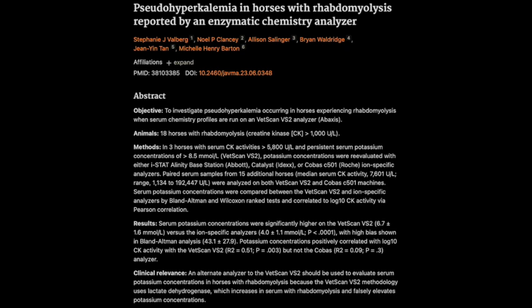So maybe it's not that vets don't know about it. Maybe it just gets lost in the shuffle. Yeah, it's easy to get overwhelmed with information sometimes. But either way, this situation really shows you how important it is to think critically in vet med. Oh, absolutely. You can't just rely on the numbers from a machine. You've got to look at the whole picture. Connect the dots. Use your brain.